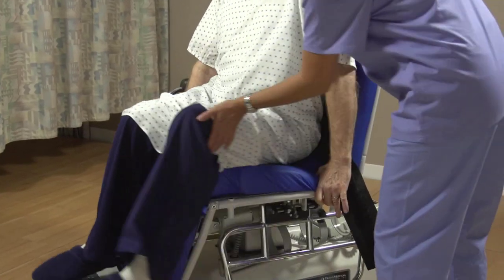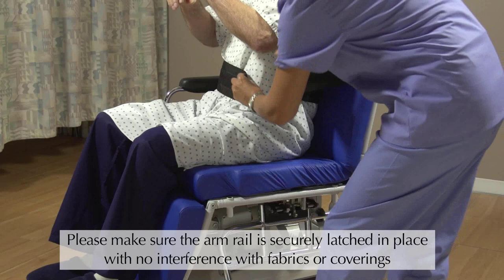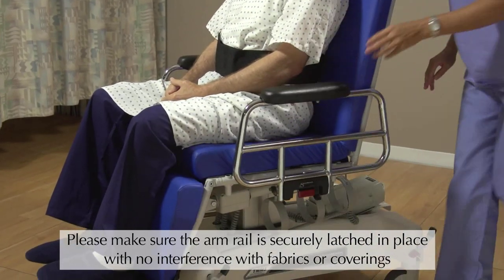Your patient is going to rest on a thick cushion with memory foam, which is extremely comfortable. Once your patient is seated, pull the rail up until it latches in place.